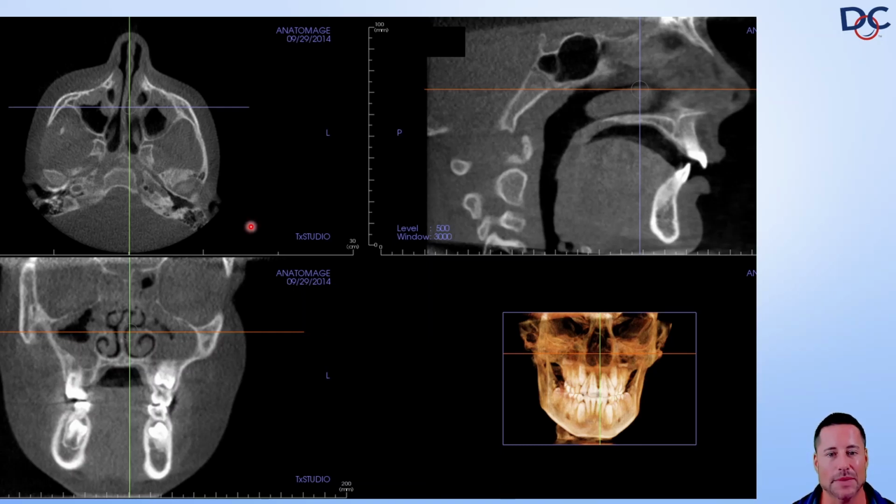I mean, it's unbelievable. Look at the coronal slice, the rhinosinusitis, the essentially complete obstruction of the right ethmoid, with a little patency on the left side. And this patient is suffering. Look at these opacities. When I asked the patient if she had symptoms, Mom interjected and said she complains of headaches. The patient was kind of like, no. And Mom's like, well, what about your headaches? And she's like, oh yeah, I do get headaches a lot.